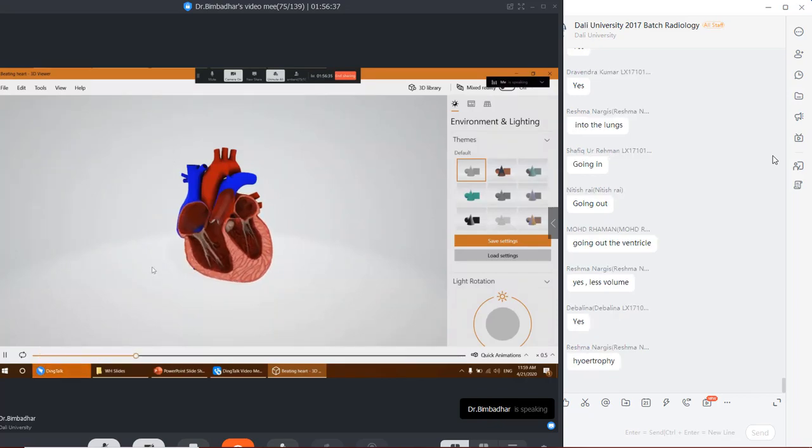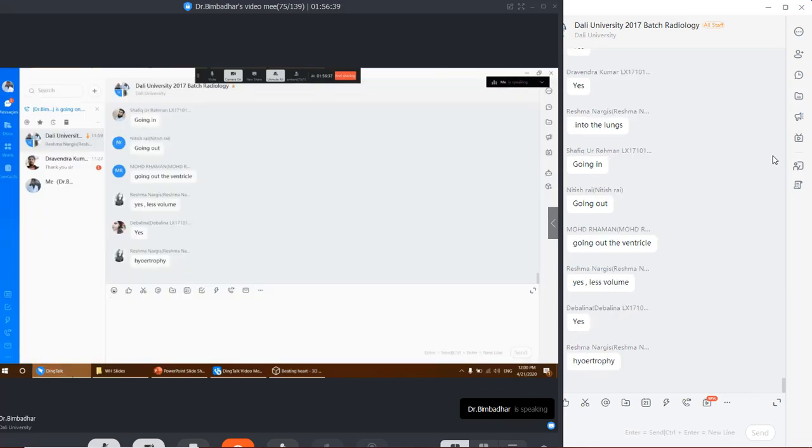Did you get it? Hypertrophies. Now you see it. Now what are the accumulating factors here? First, Kerley lines. Cardiomegaly. What is a condition that causes cardiomegaly? We learned before, congestive heart failure. Why does congestive heart failure have cardiomegaly? Because of the compensation mechanism.